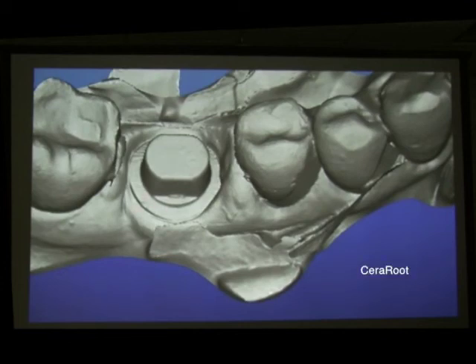This is a one-piece implant, as you have seen, but the design of the implant is made because sometimes the implant is placed more lingually and sometimes more buccally, so we don't need a huge abutment for the big size of the implant. And by this I mean that when you take an impression and scan this type of situation, here we have full visibility of the shoulder, which is more or less 1 millimeter thickness, but here we don't have visibility of the margin. So interproximally, we never use an electrosurge or laser if we see the shoulder. So the crown doesn't go all the way to the margin. The crown stays almost halfway into the margin. The more space we give to the gum, the healthier the papilla is. So just by having this amount of shoulder doesn't mean that your crown has to have the same thickness.